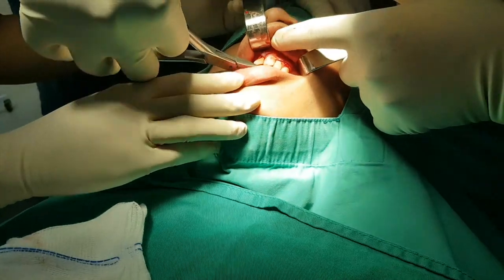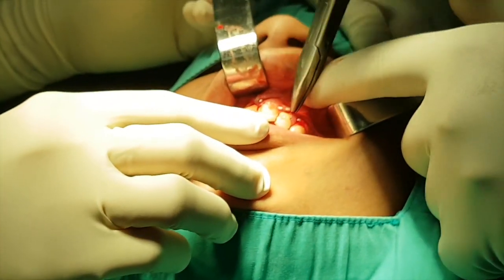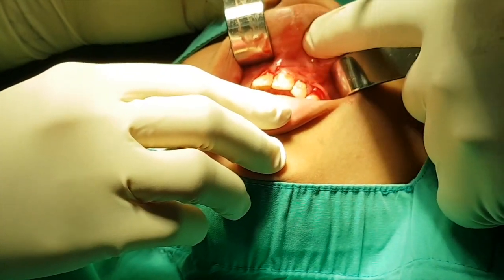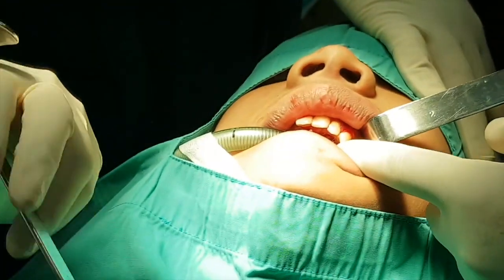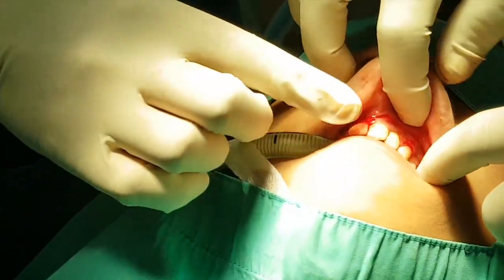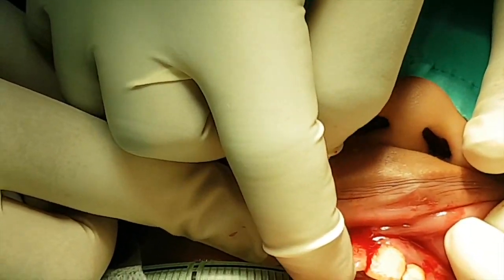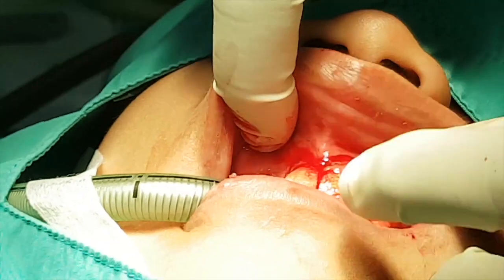Four months later, we removed the wires and had an inspection of the area. We took out the ligature wire from those transplanted teeth — it was not a difficult procedure to do. We checked that the area was moderately healed and the teeth were not mobile, and we confirmed that the vitality of the teeth was quite positive.